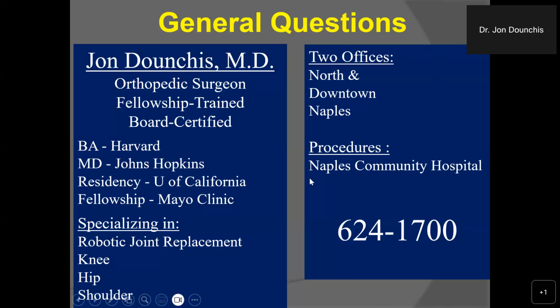So in other words, further measurements are made intraoperatively to further determine the natural function of that joint. Now, with all that information in the system, we can accurately determine the natural ideal function and position of the joint. And then we utilize the robotic technology to properly place the new surfaces in a three-dimensional fashion so that the natural architecture of the joint is reestablished. The ligaments and the mechanics of the muscles around the joint are now back to their optimal position.